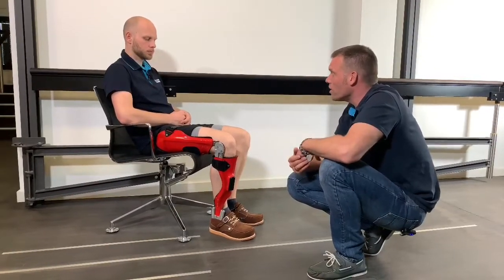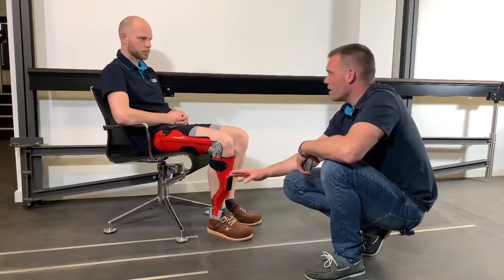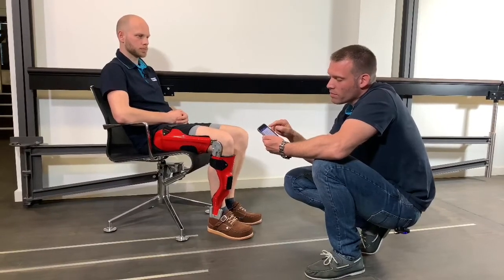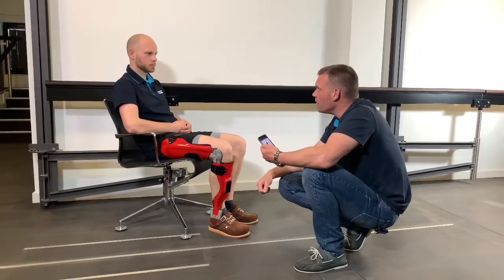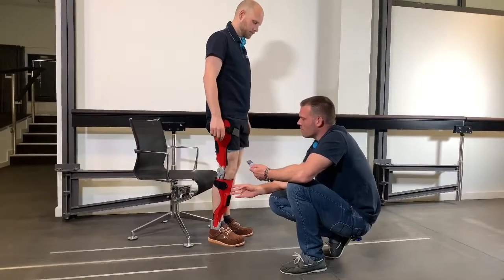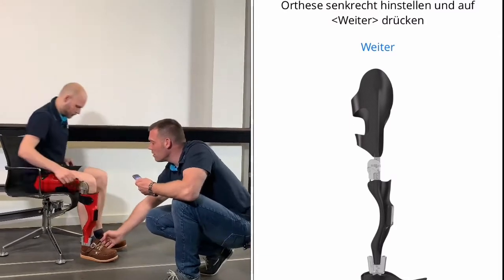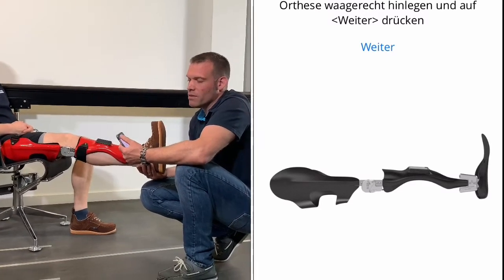Before we start checking the dynamic alignment, the system should exactly know where the sensors are located in space — that means we have to calibrate them. I have connected the system with my expert app. I select in the menu: settings, calibrate, and follow the instructions on the device. Place the orthosis vertically — that means in your case, please stand up. Then stand still for a moment. Then I press okay. Then you have to sit down again. I unlock the joint and we stretch the leg horizontally, then press forward. That concludes the calibration process.